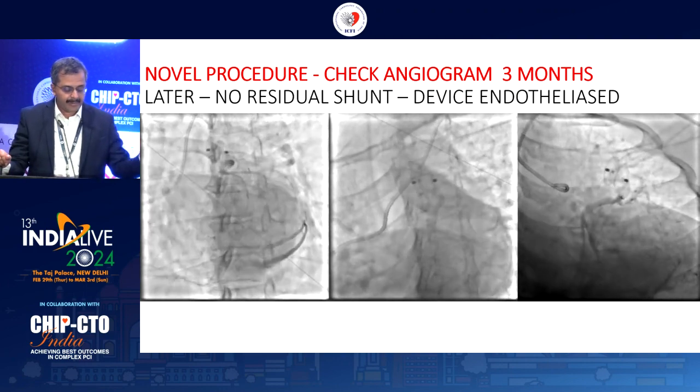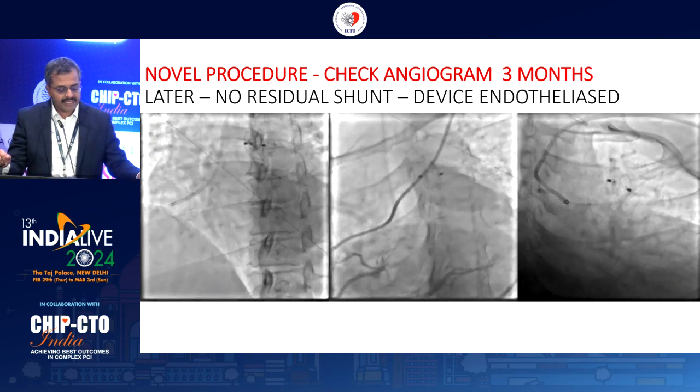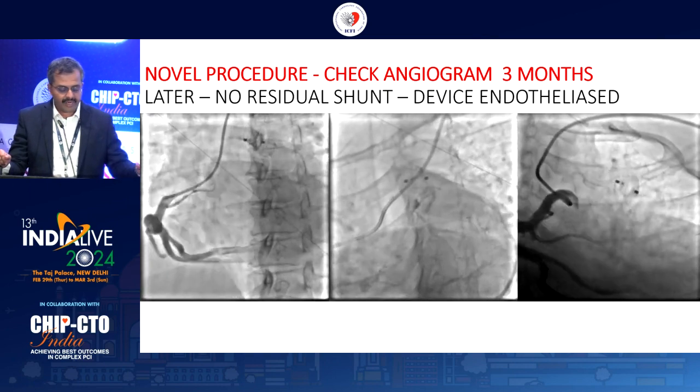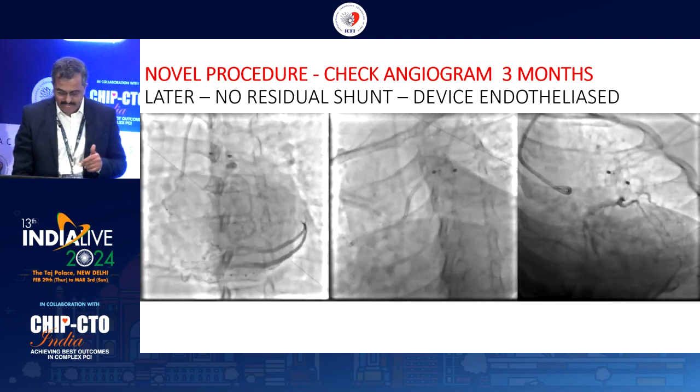So we get the patient back on follow-up, and we do a check angiogram after 3 months. The entire shunt is closed off. The device is fully endothelized. There is no residual shunt across the Alcapa. You can see the device is fully endothelized.